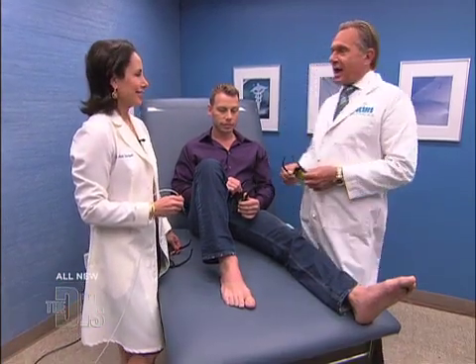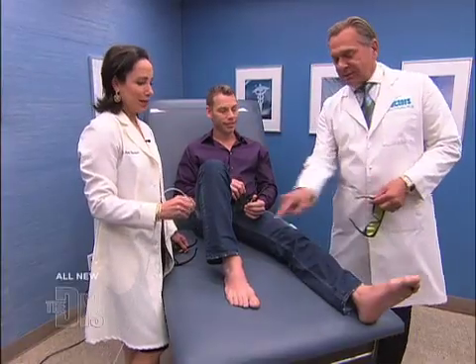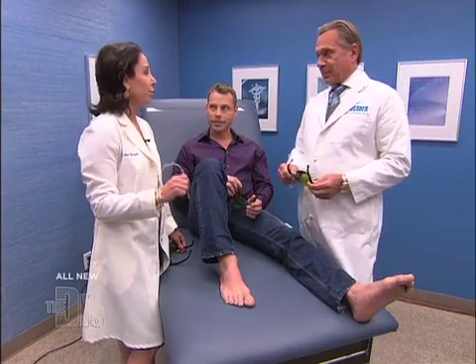And to show us how it works is my friend, my colleague, our favorite dermatologist, Dr. Ava Shamban, and our patient, Garrett. Garrett, we gotta take care of those toes. Absolutely — so this pinpoint laser is heaven-sent for all of us who suffer from terrible toenail fungus.